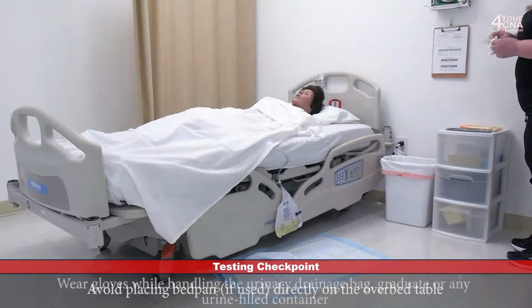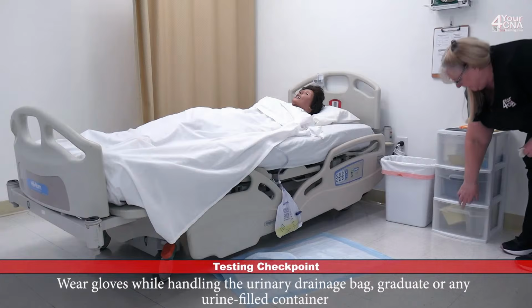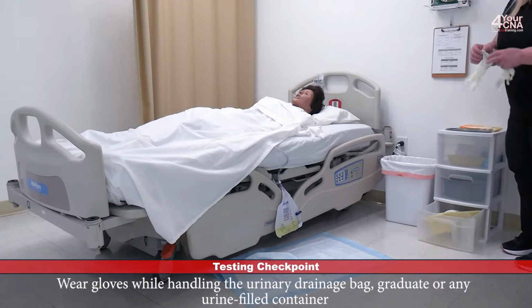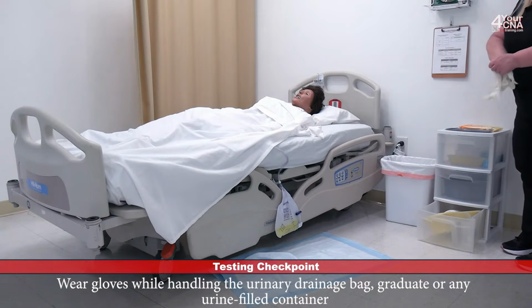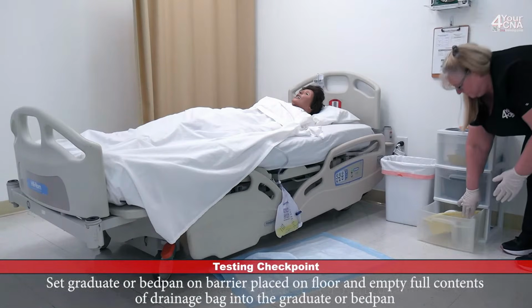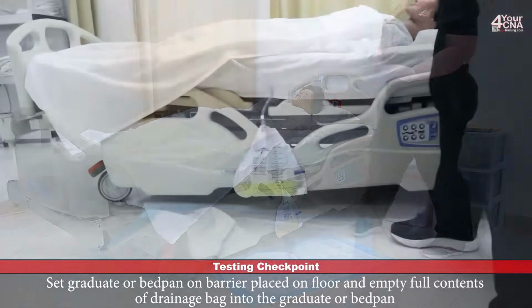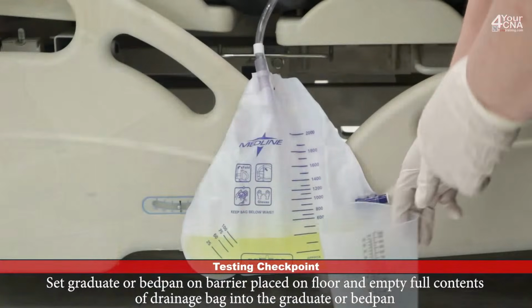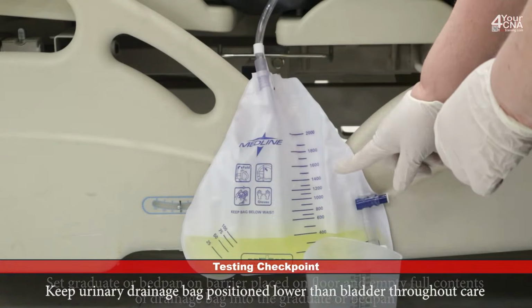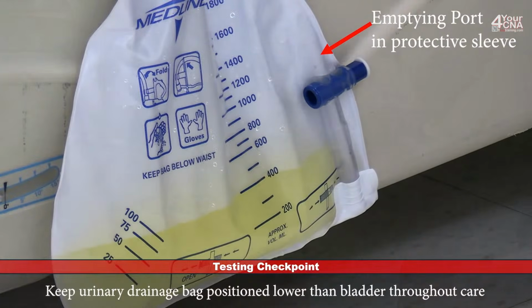I'm going to go get a set of gloves. And we're going to get the graduate container out of the drawer. You need to make sure that you put your gloves on before you get the graduate container. We're going to place the container on the barrier directly underneath the bag. We use the emptying port to empty the bag.